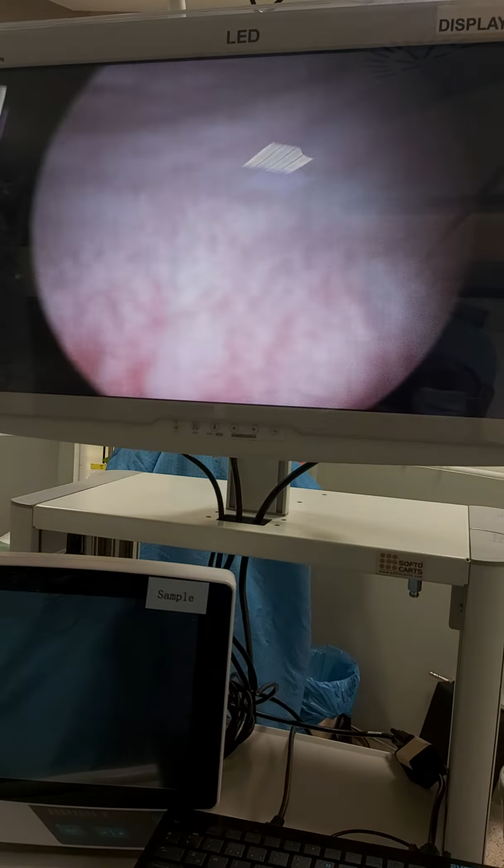And look, these tissues are abnormal patchy tissues. These are not normal bladder mucosa compared to this one. This is a good bladder mucosa. This is a Trigonitis area. Sure, she had used many antibiotics for a long term, and the superficial leukoplakia tissues are mostly healed. There are some remnants of leukoplakia, but mostly she has Trigonitis.